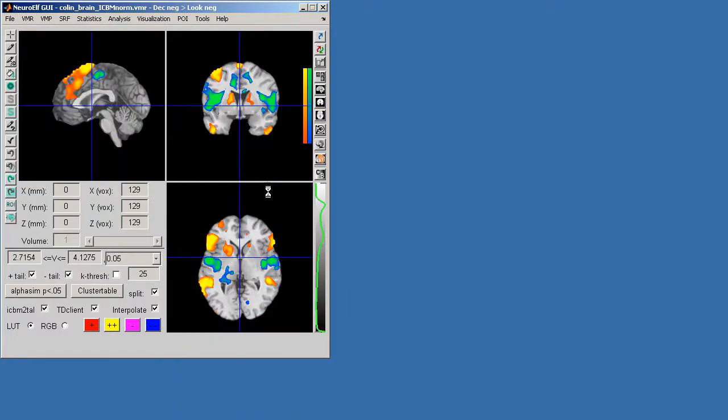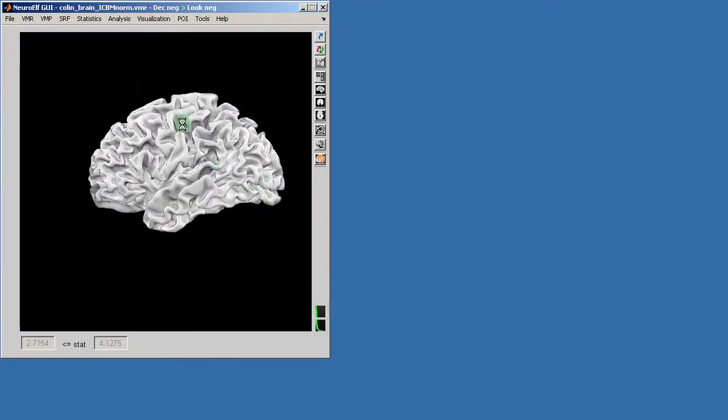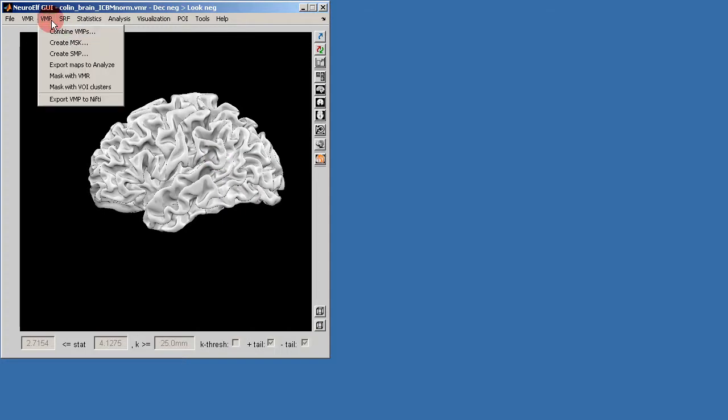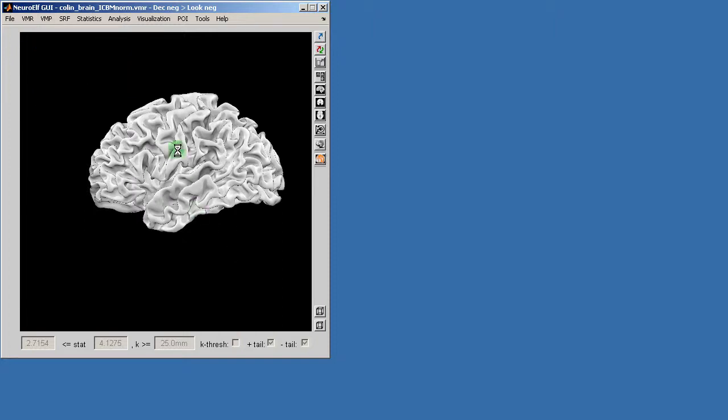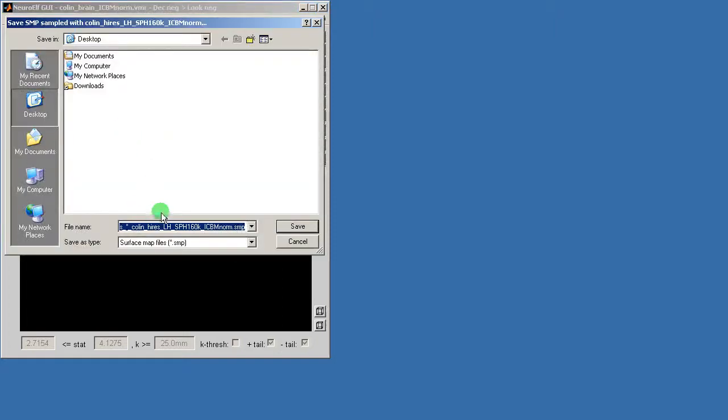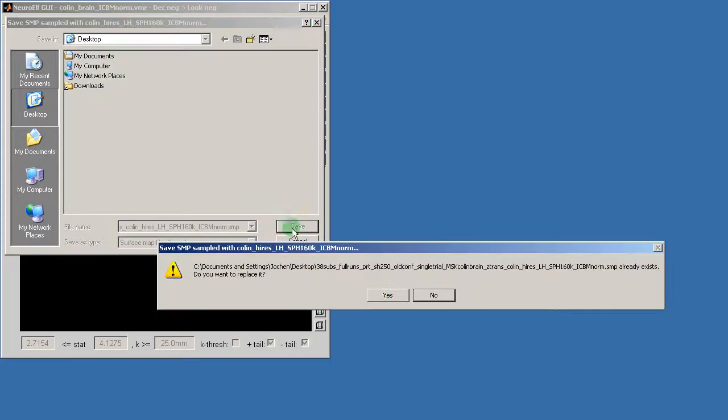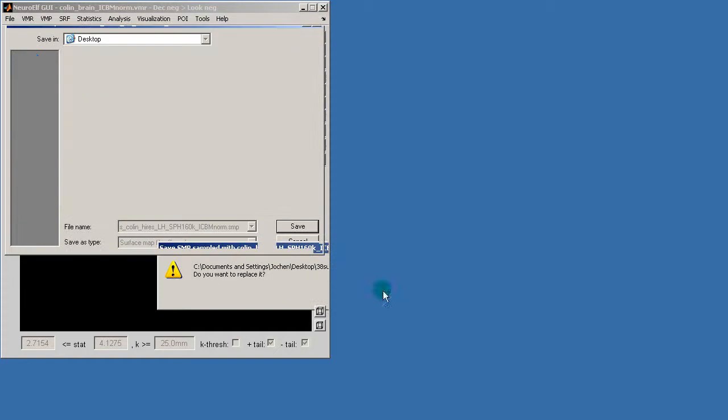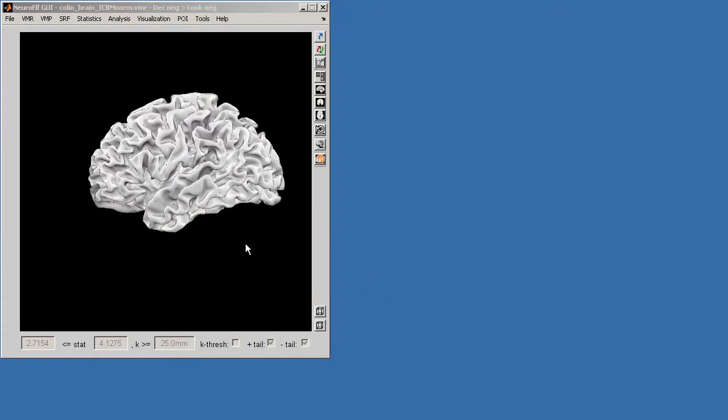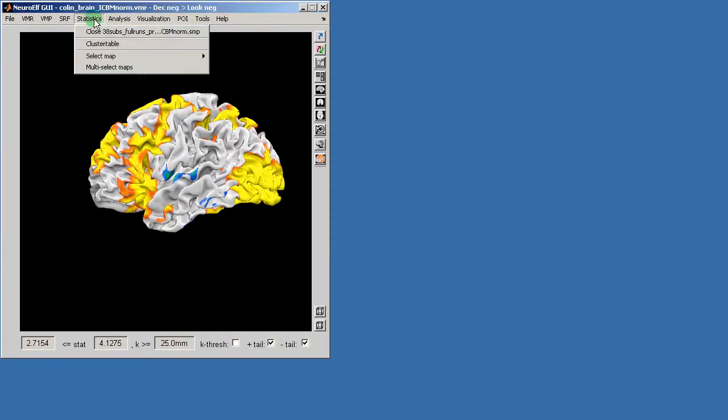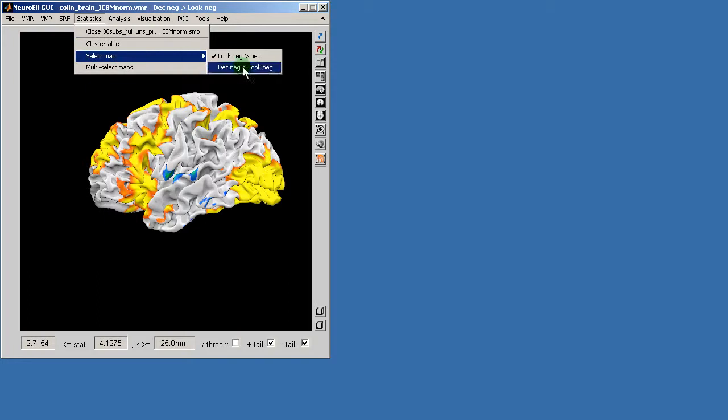Once this is loaded I can then go to the VMP menu, create SMP which will create a map for each of the available maps. It automatically asks me to save this and I will do so under filename, and then it shows me the map and once again I'm selecting the second contrast.